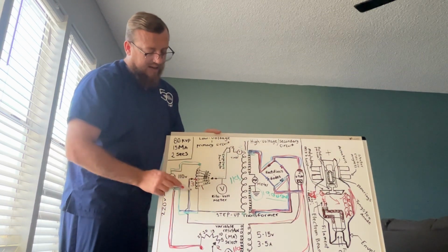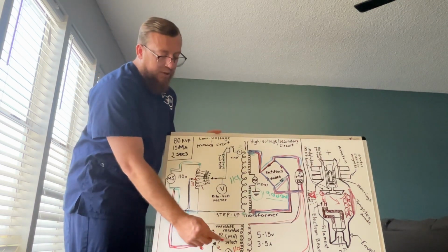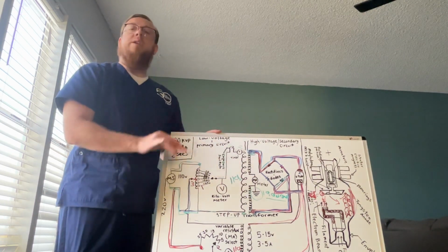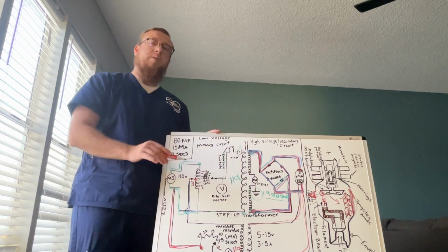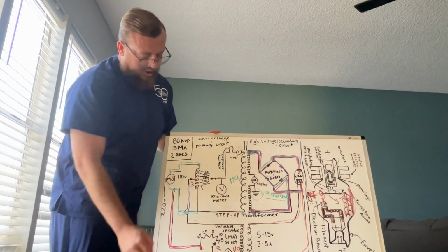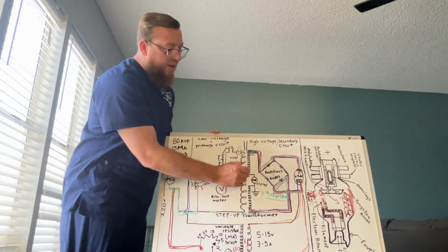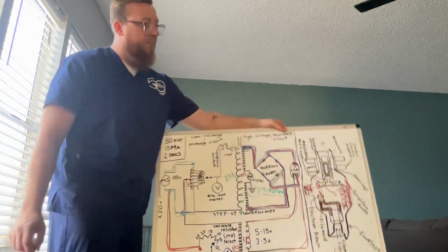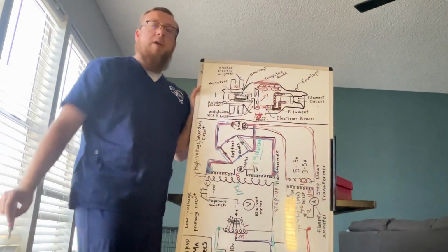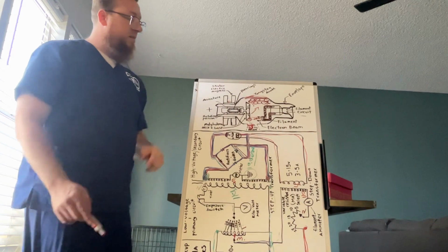If it was direct contact, this, which is meant for the kVp, will read what I put on the MA selector, and it will rerun and it will mess up the whole circuit. So that's why it's only going to be induction and no points of contact, so it doesn't confuse the machine or the circuit. So we have 1 induction, 2 induction, 3 induction, 4th induction for our step down transformer, 5th induction for our step up transformer, and our 6th induction on our stator electromagnet. And that makes the anode spin even faster. This is my presentation, and that completes it.